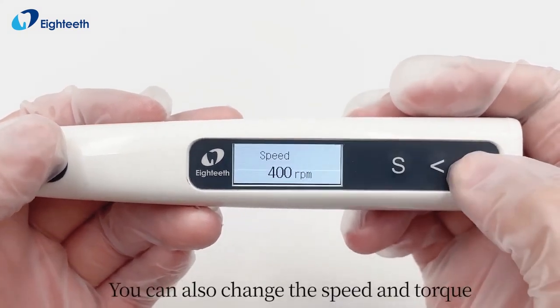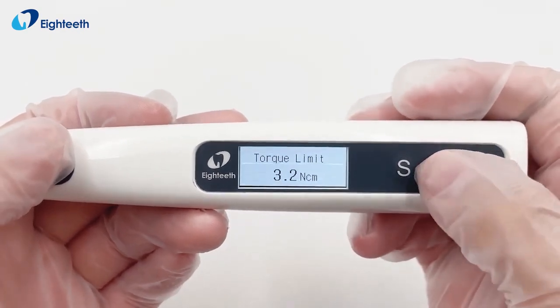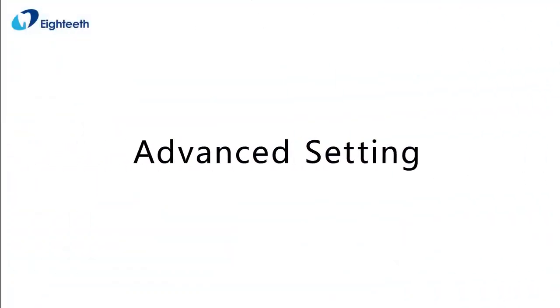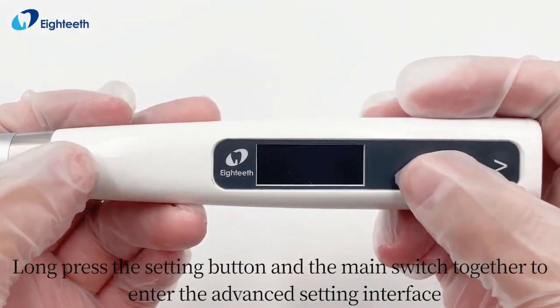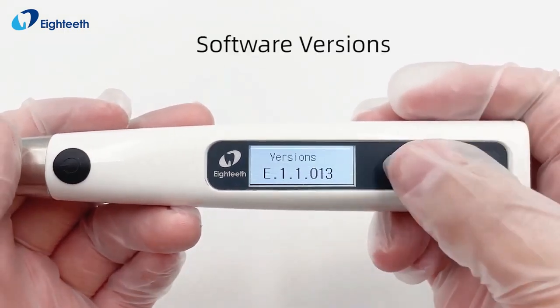You can also manually change the speed and torque. Long press the setting button and the main switch together to enter the advanced setting interface.